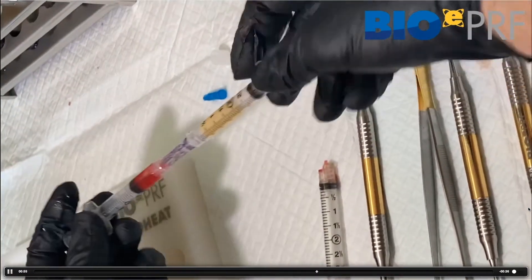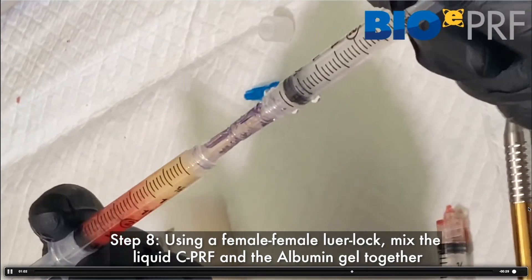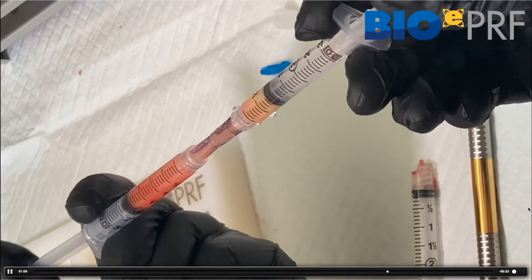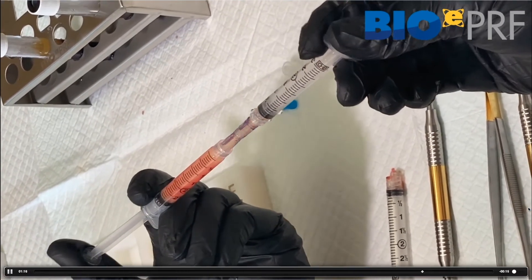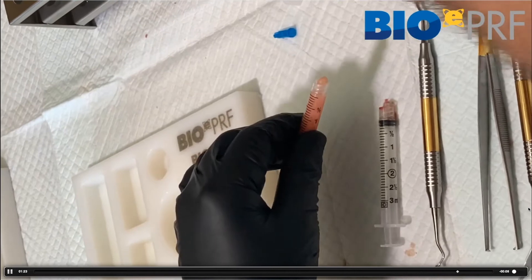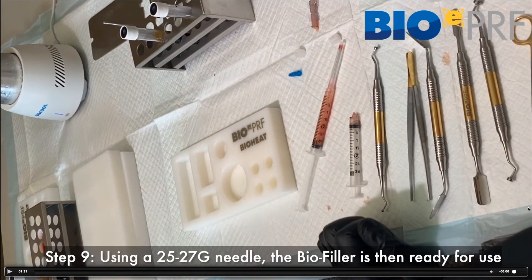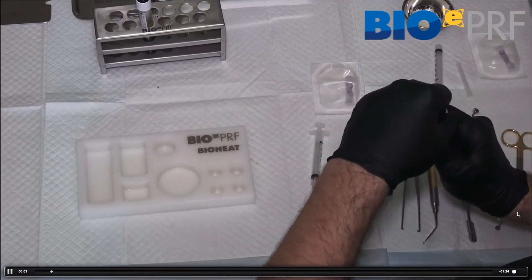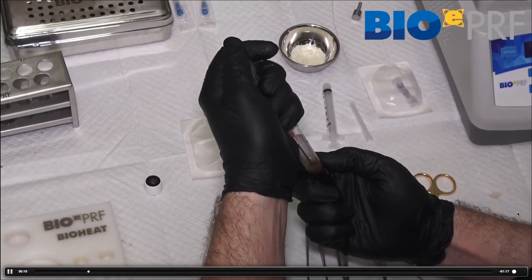That's how we create the Alb-PRF, which stands for albumin gel and liquid PRF — also referred to as E-PRF, for extended PRF — and that's what we inject as a facial filler. We mix back and forth, typically about 10 times. If there are a few red blood cells you can see the colors changing as it mixes. Once uniformly mixed, we attach whatever gauge needle we want — typically 25 to 27 gauge — and it's ready for biofiller injection.